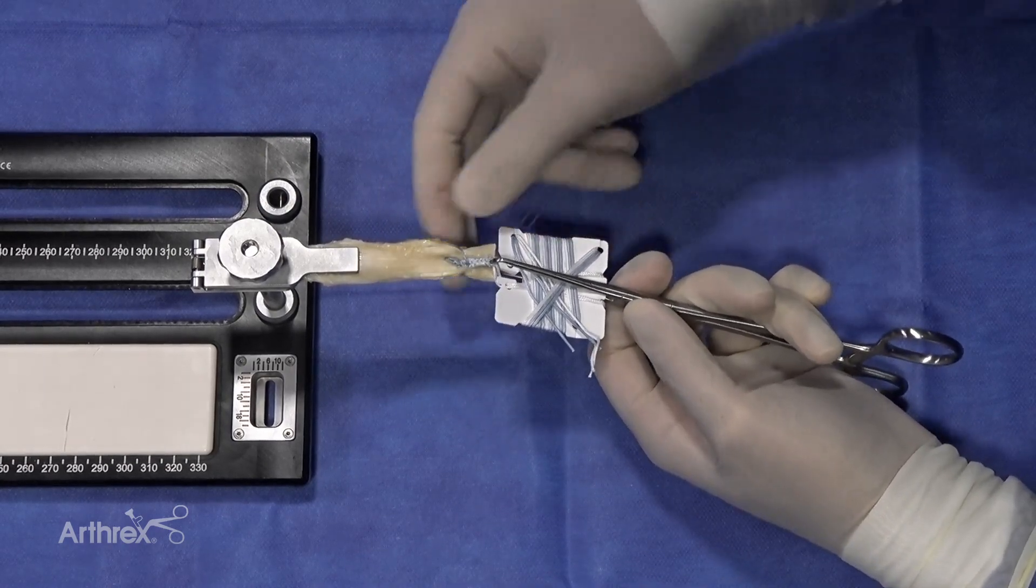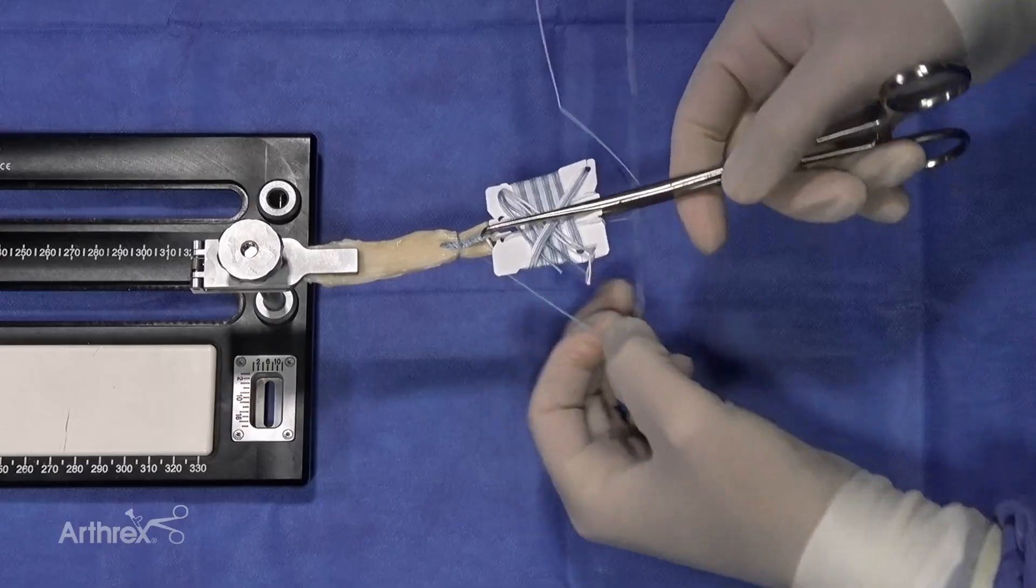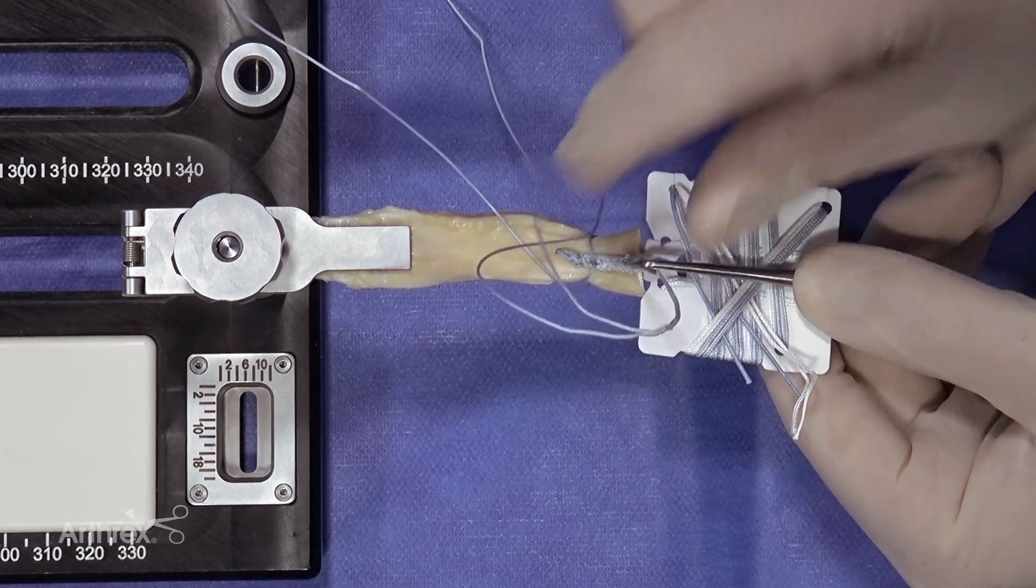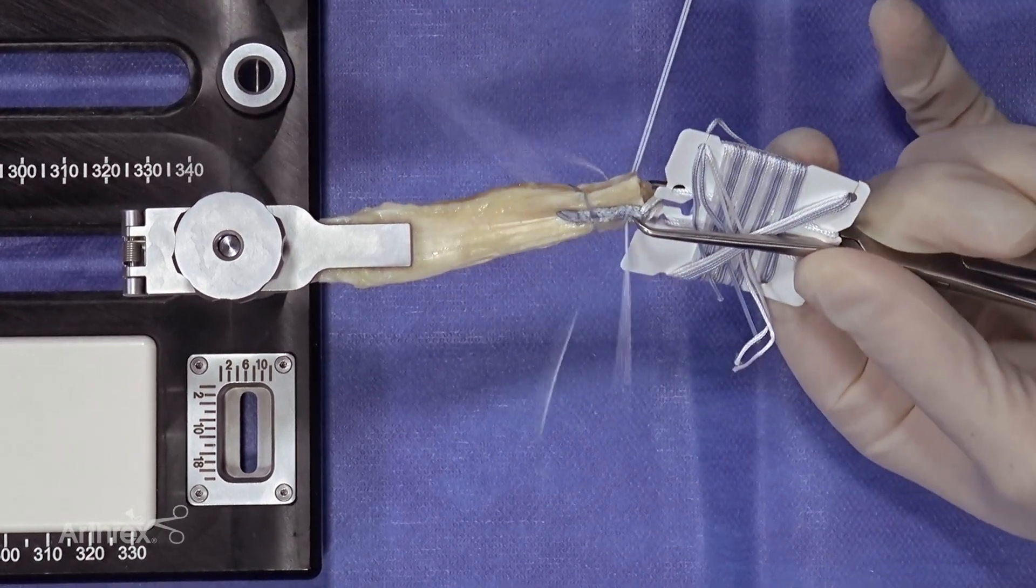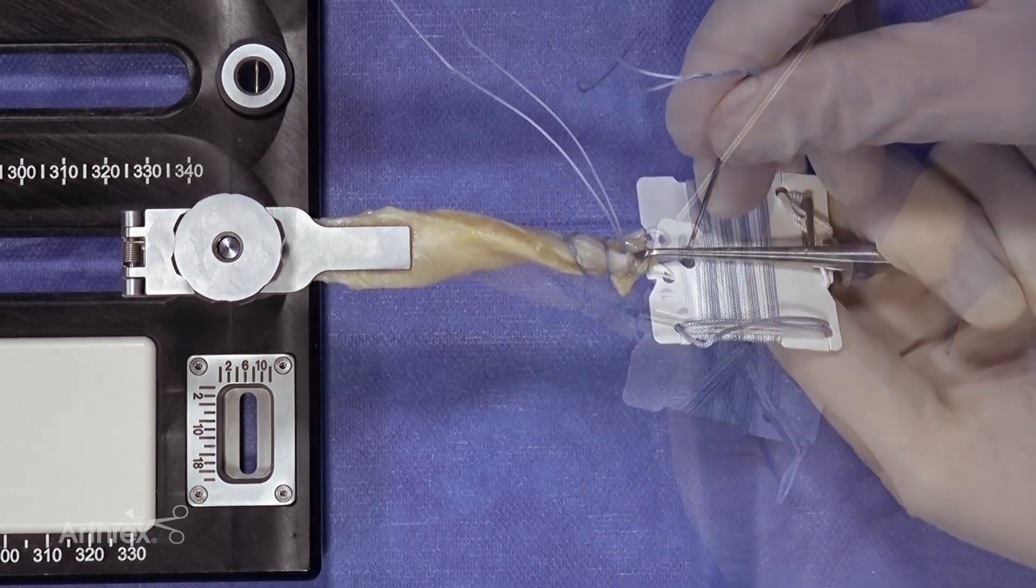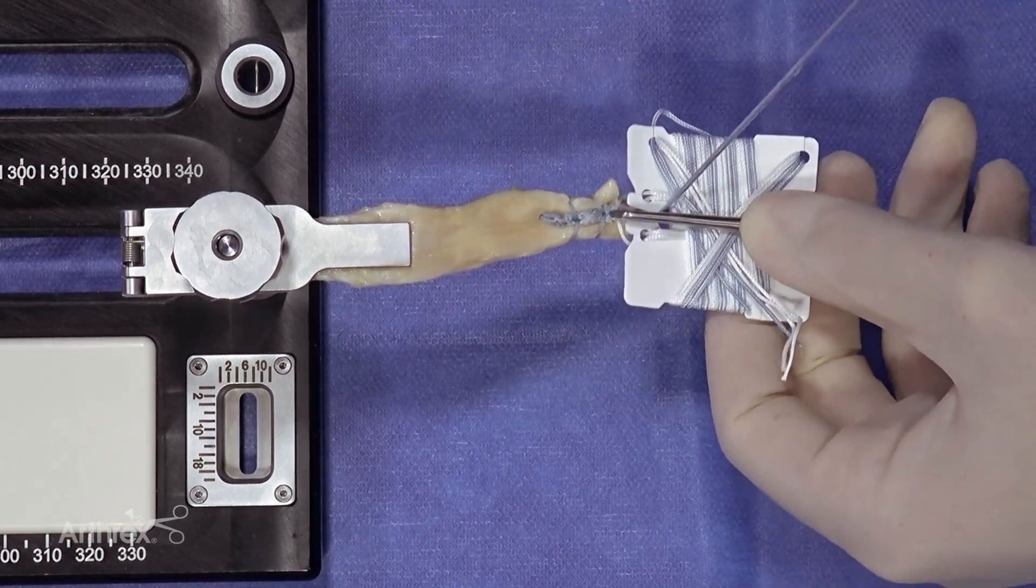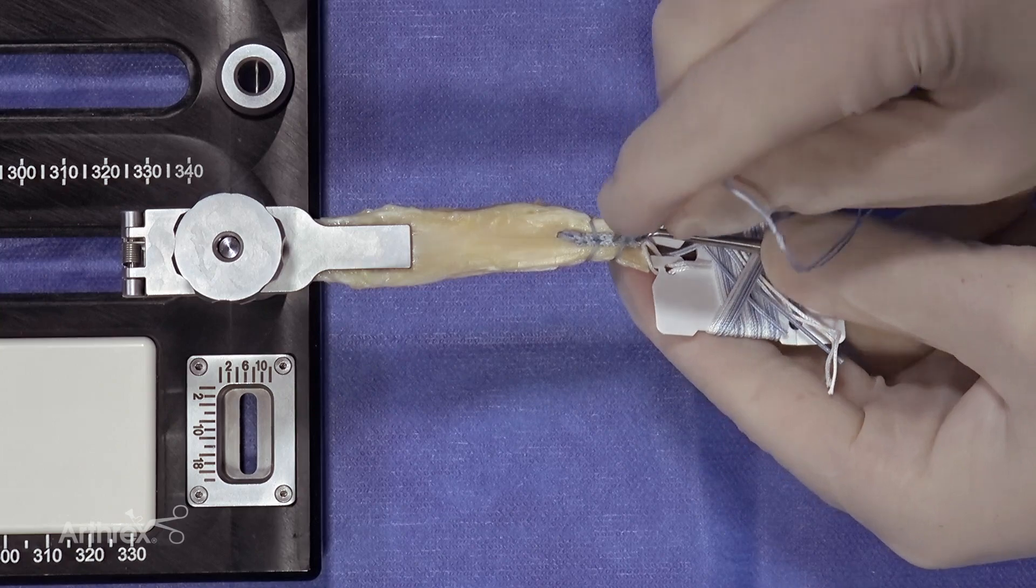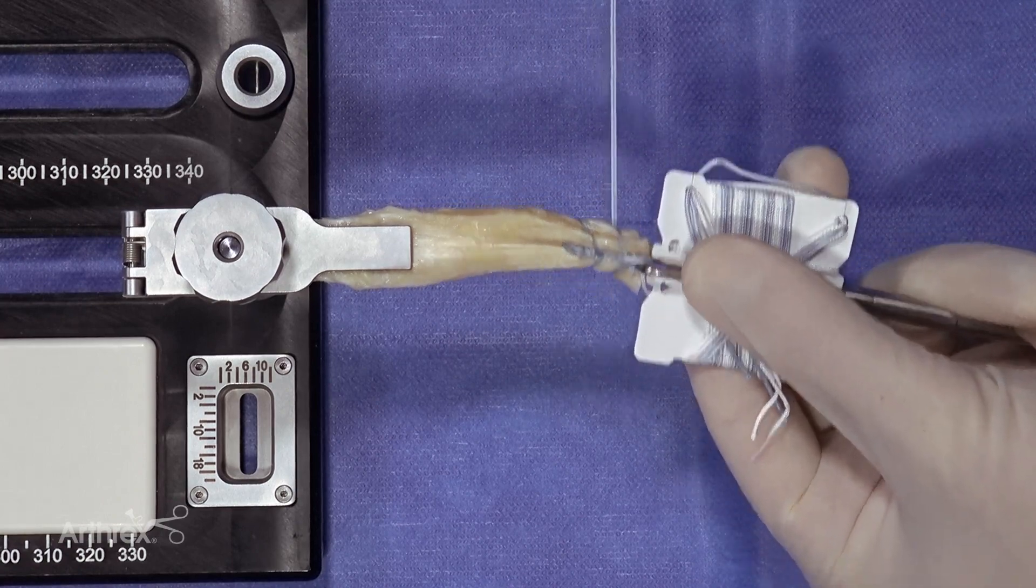We pull hard to tighten it down, then take the loop and go around. We then put the needle through at the junction of the fiber tag and the tightrope. Again, we're pulling these strings together to tubularize the graft. You can see it's very nicely tubularized there. We then flip the paper over, put the needle through the hole, pull it through, and this reinforces that junction between fiber tag and tightrope. We then pierce the location between the previously thrown stitches and tighten it.